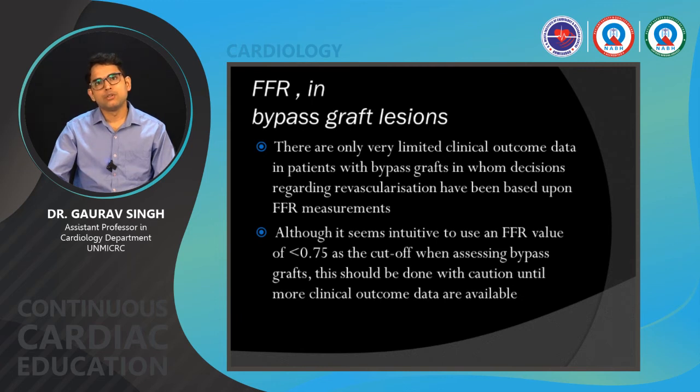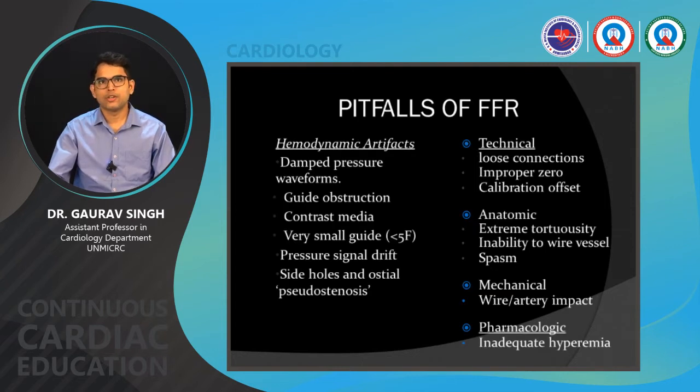Although it seems intuitive to use an FFR value of 0.75 as a cutoff when assessing bypass grafts, this should be done with caution until more clinical outcome data are available. There are certain limitations of FFR also.